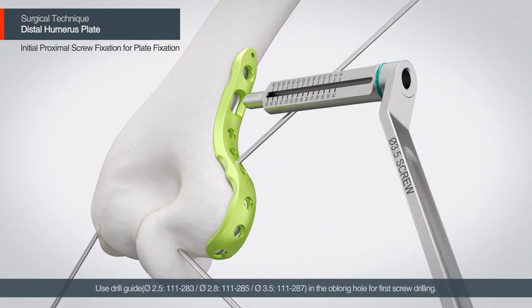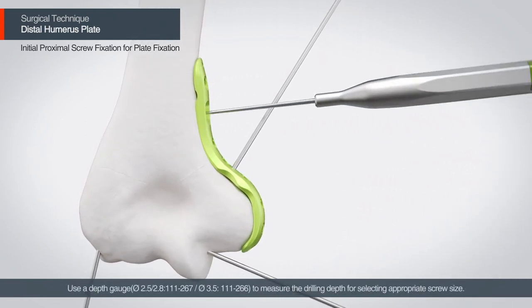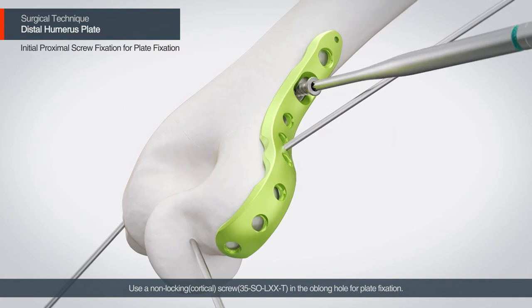Use a drill guide in the oblong hole for the first screw drilling. Use a depth gauge to measure the drilling depth for selecting the appropriate screw size. Use a non-locking screw in the oblong hole for the plate fixation.